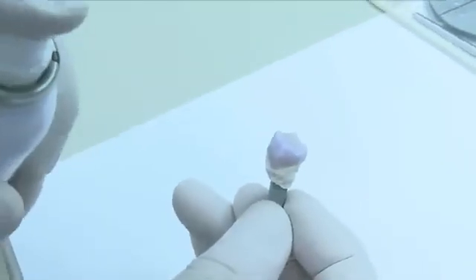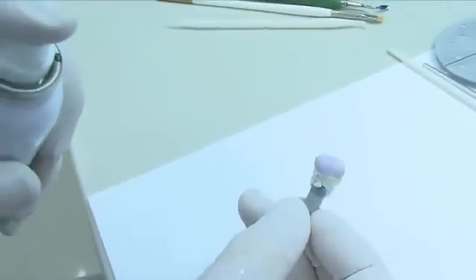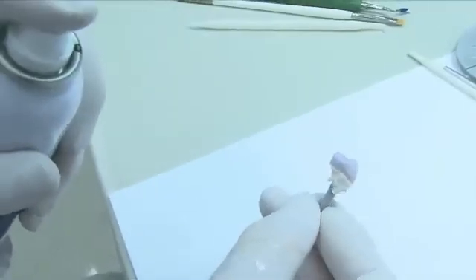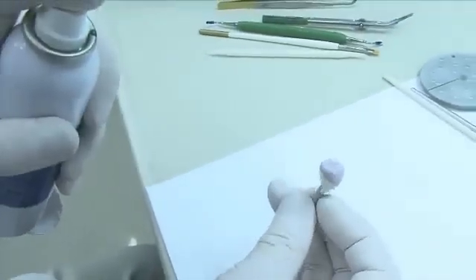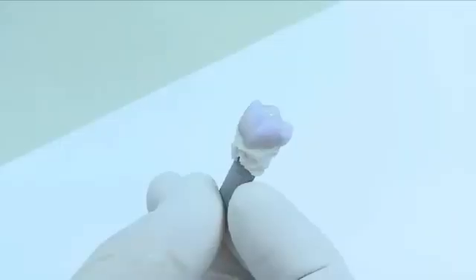Apply short bursts of spray to each axial wall of the restoration, followed by the occlusal surface. Allow the restoration to dry. A matte white look should begin to be apparent on the restoration. Apply a second coat of glaze spray and evaluate the results.